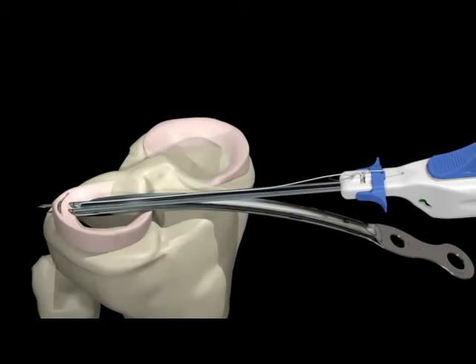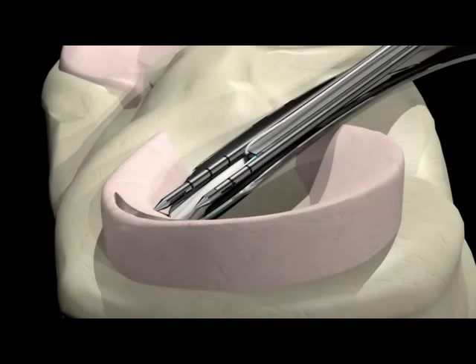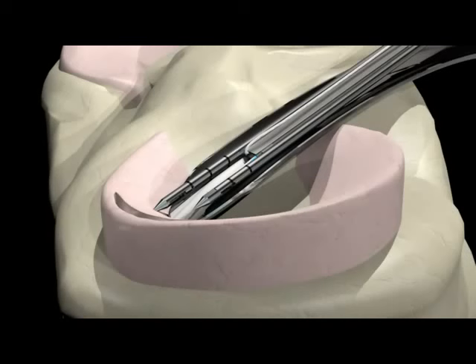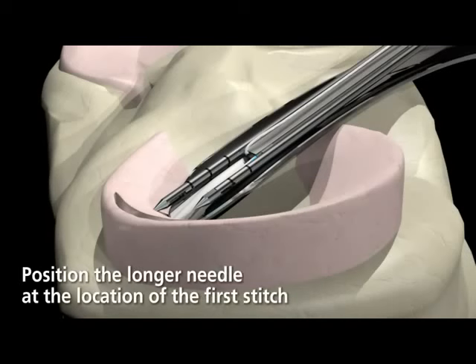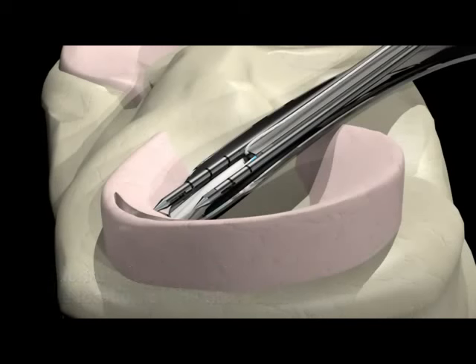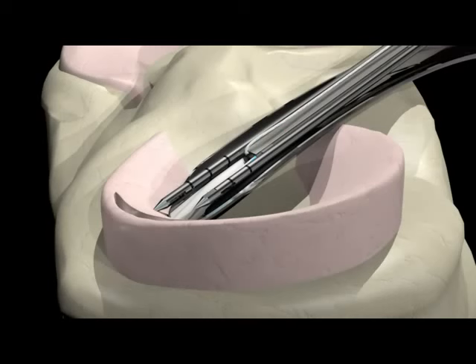Carefully advance the AS meniscal repair device against the meniscus at the predetermined point of penetration at the repair site. The alignment of the needles on the device is critical — they are not designed or intended to manipulate or position tissue. Do not subject the device to forces that may misalign or bend the needles, as doing so may affect their ability to place and/or pass the suture.